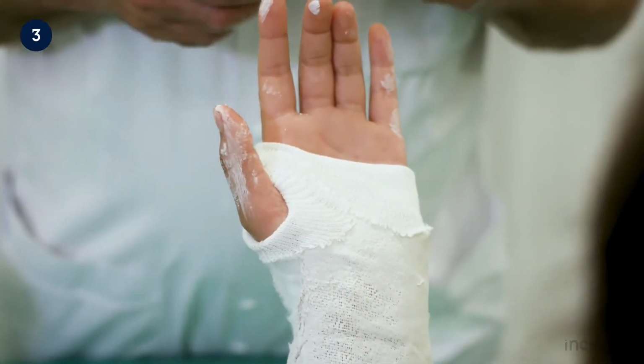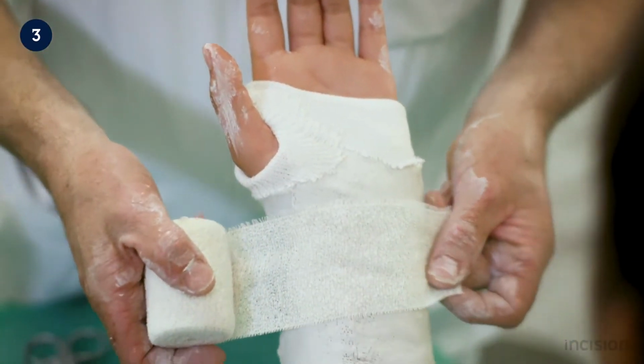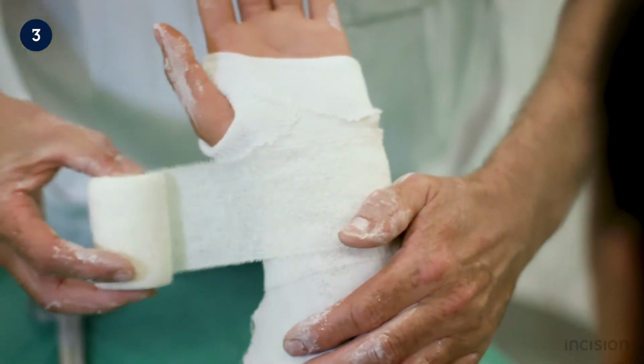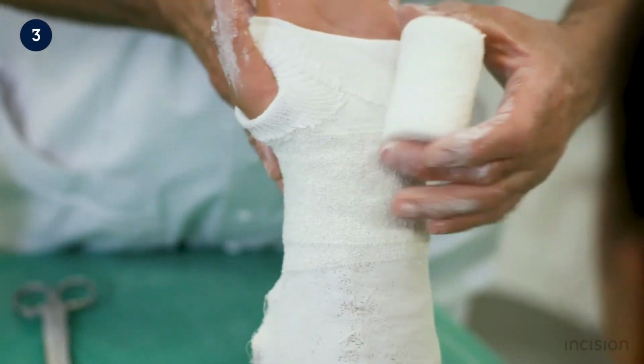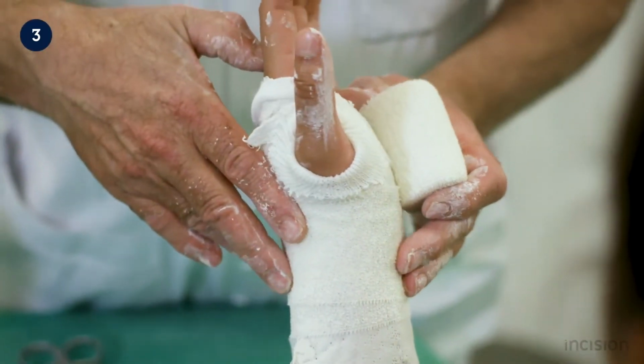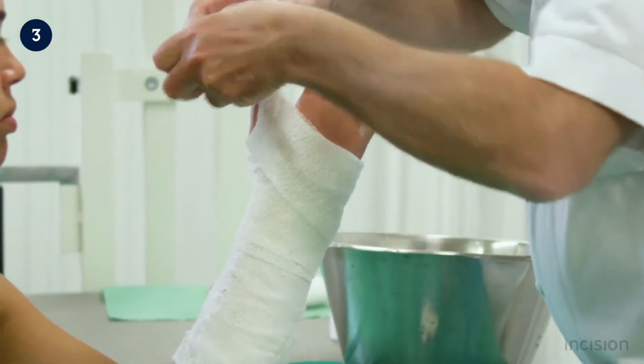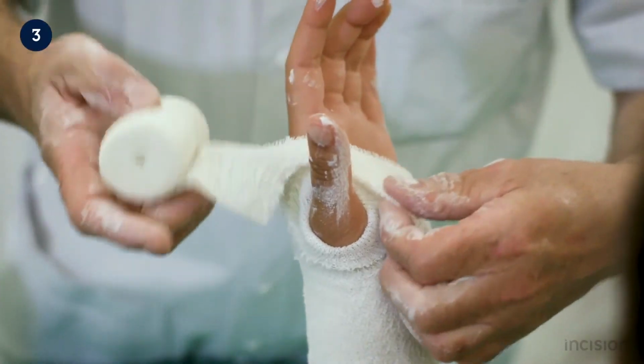Thereafter, the elastic wrap is applied to the limb in the same manner as the padding, with the flat part against the surface of the plaster and rolled in the same manner as the padding was previously. After the wrist joint is encircled twice, the wrap is cut and placed in the first web space.